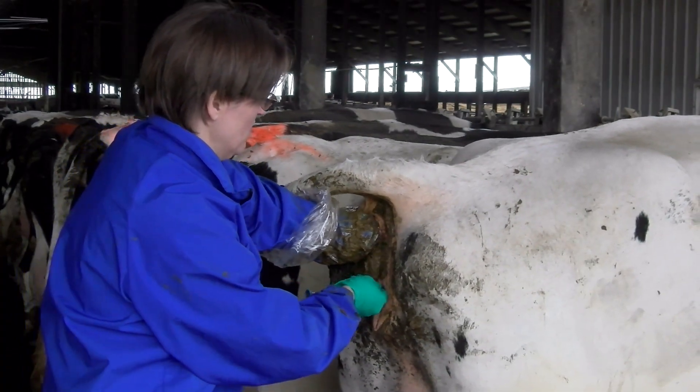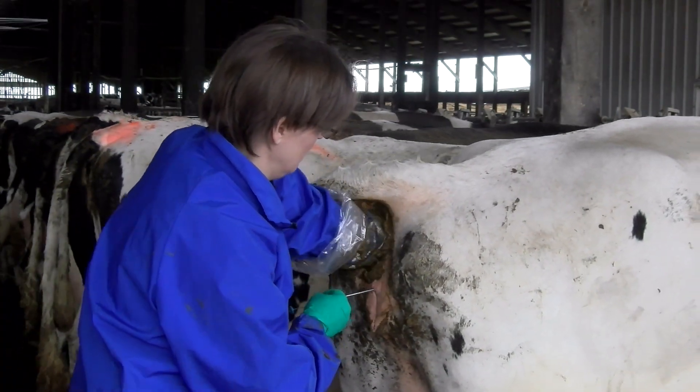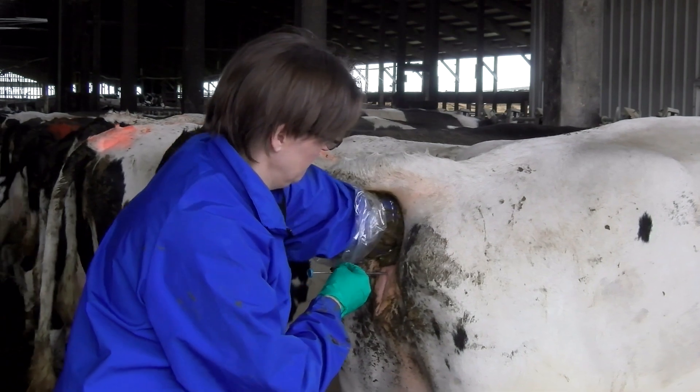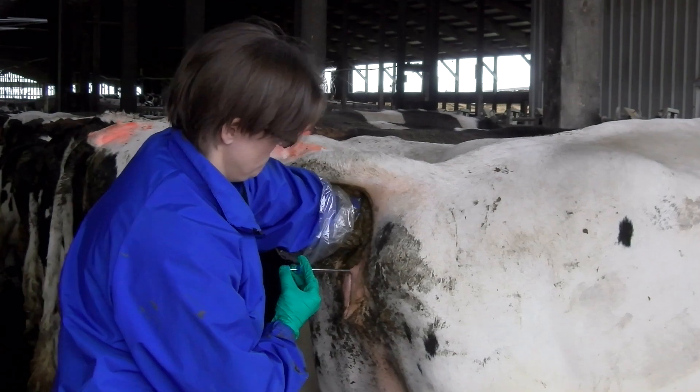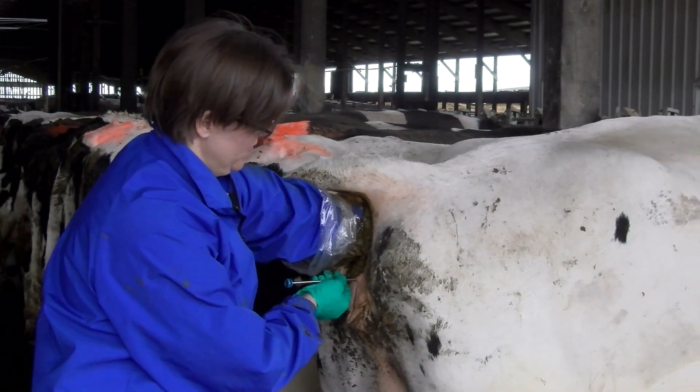Once you have loaded the AI gun, insert it into your shirt to keep the semen warm and out of direct sunlight. Remember, we recommend that semen be deposited into the animal within 10 minutes of thawing. Make sure that the animal is locked up for AI and work efficiently when a loaded gun is prepared.